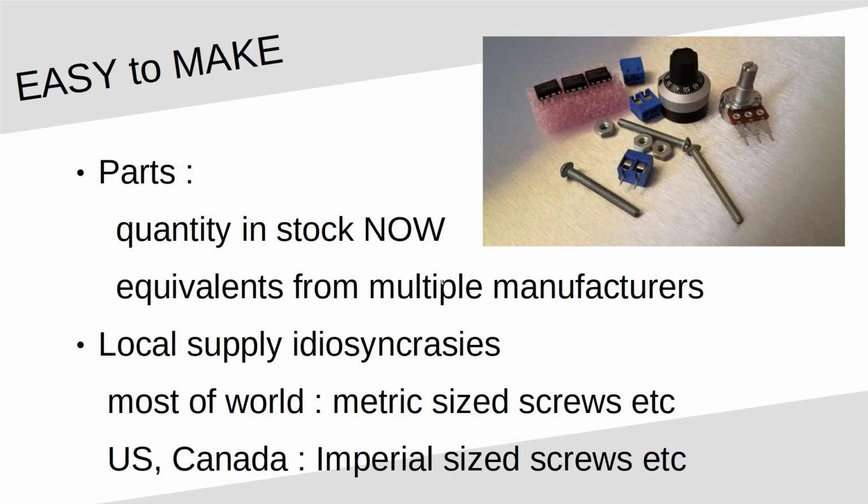So if you're looking at some sort of a switch for your ventilator and the manufacturer shows that it has 45,000 in stock, that's probably not a bad choice. If it shows that there are 45 in stock, well, that's probably not the best choice for a switch. Same thing applies to every other part.